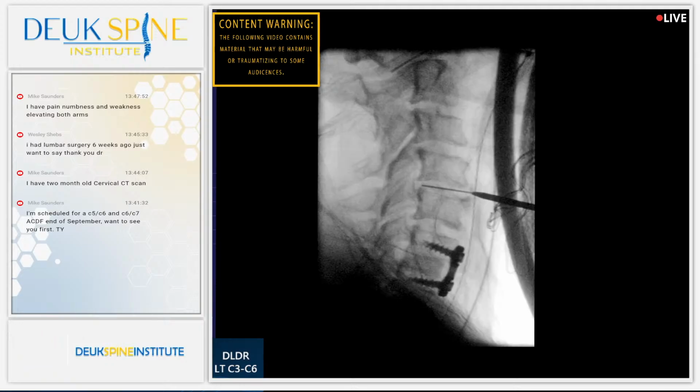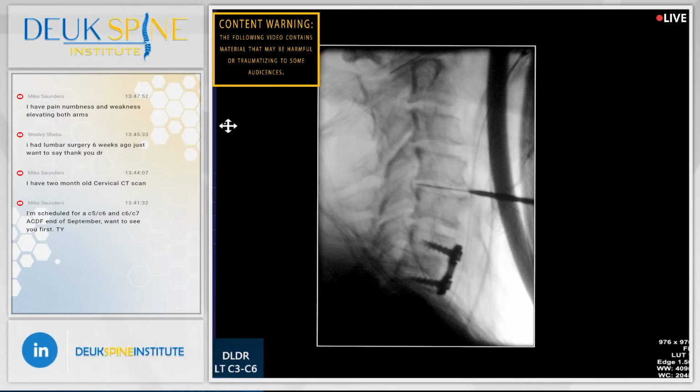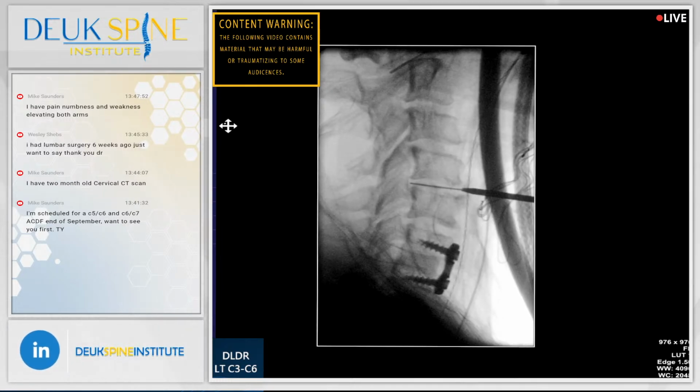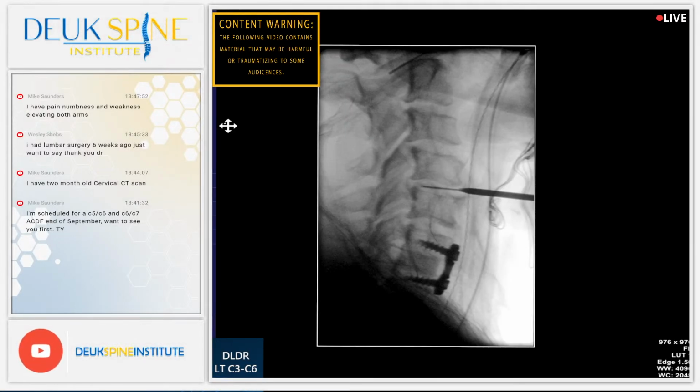Shot. All right, so I'm making my way down to the next disc. So we've already fixed the one above the fusion. We're going to go for the next one above that. Shot. I don't need anything. Thank you, though. Give me an AP. Pressure. Any questions? No current questions.